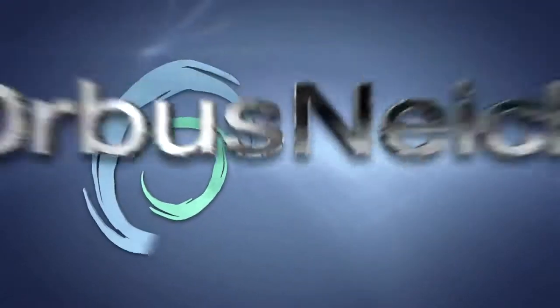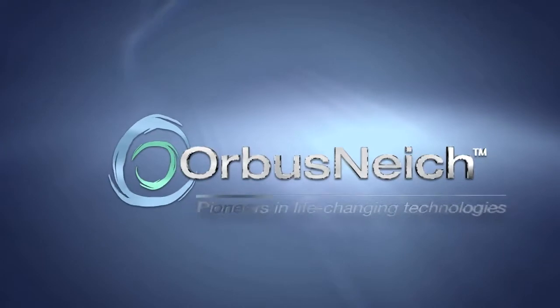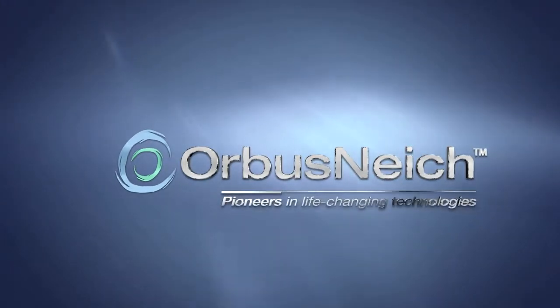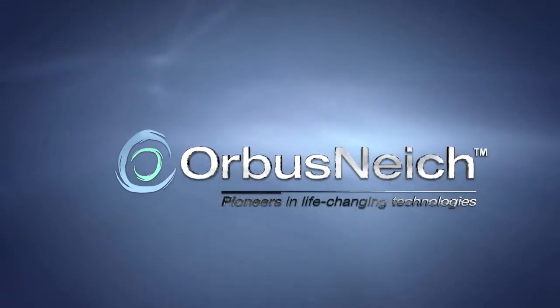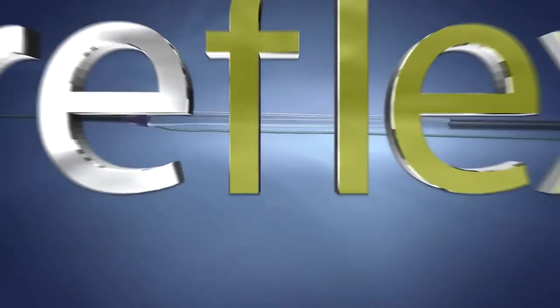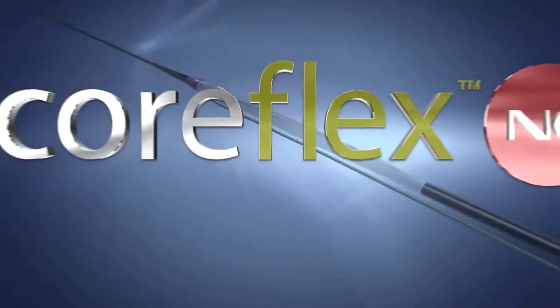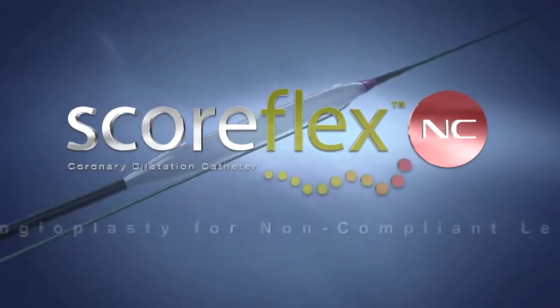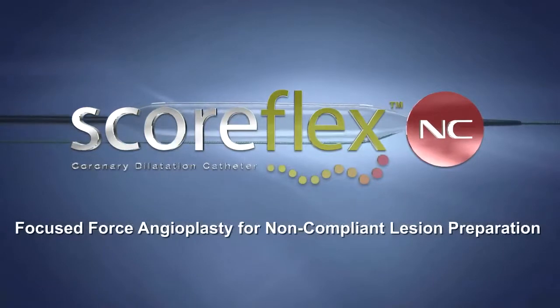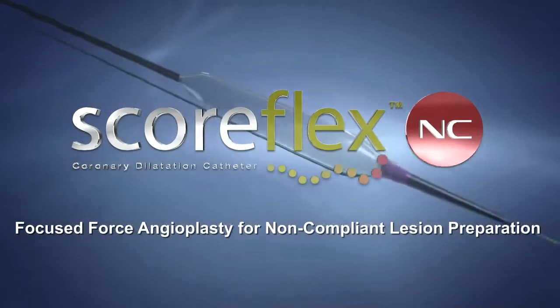Introducing the SCOREFLEX NC Dual Wire Balloon from OrbusNeich, a global pioneer in the provision of life-changing vascular solutions. SCOREFLEX NC is a dual-wire focused-force dilatation balloon, which creates predictable stress patterns to facilitate safe and controlled non-compliant plaque modification.